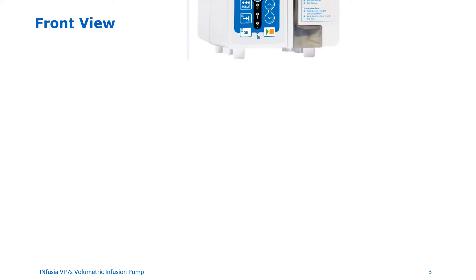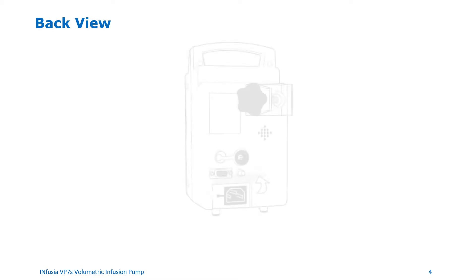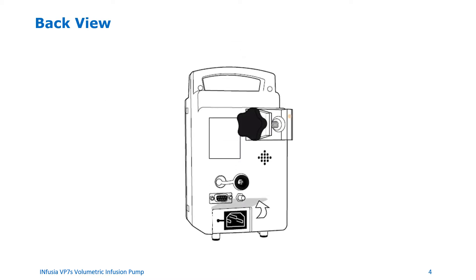Front view of the device. At the top you will see the handle. The area of the pump with the screen and the keys is referred to as the front panel. The area to the right is the pump door, on which you will observe the metallic lever. On the back of the pump, the pole clamp is used to secure the pump to an IV pole or a cage. There is also a drop sensor connection socket and an AC power inlet.